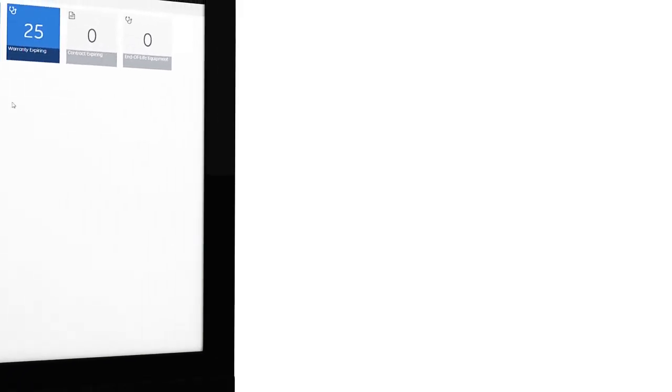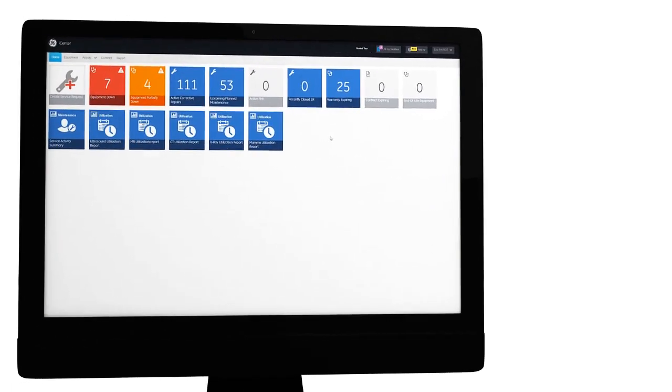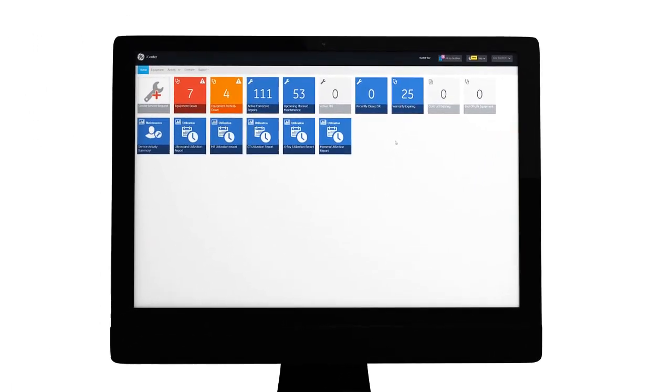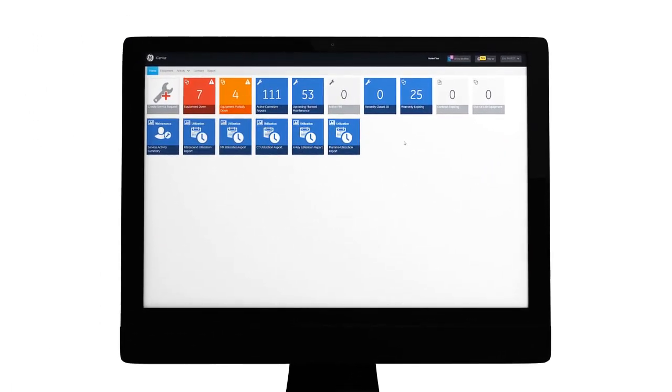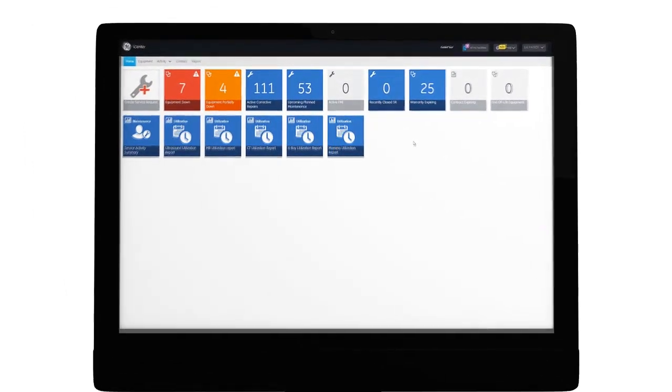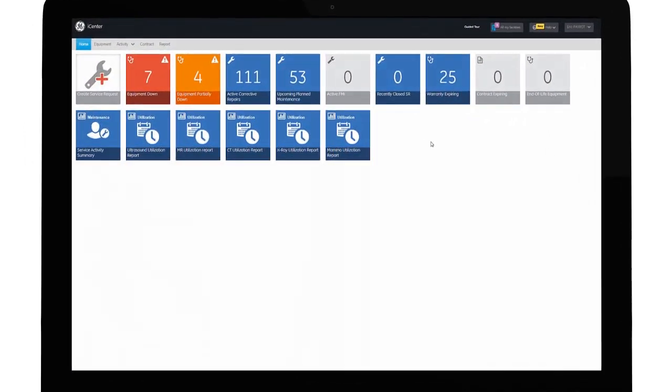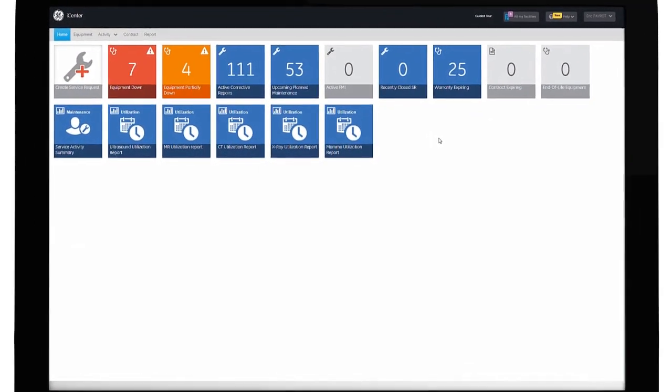Welcome to iCenter. iCenter is a secure online tool that provides visibility to asset operational and utilization data with 24/7 access.